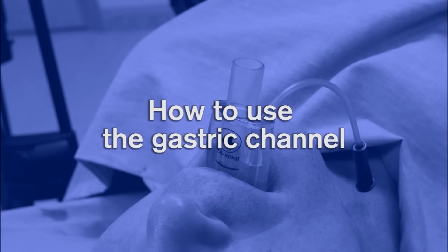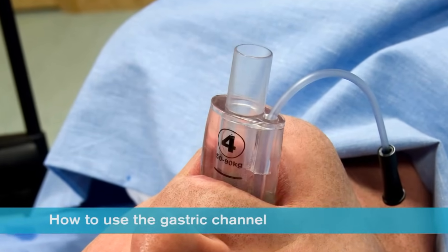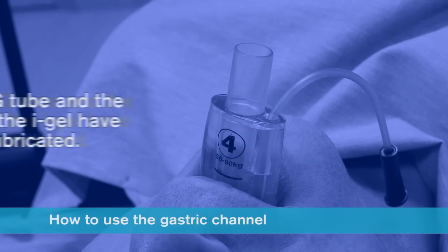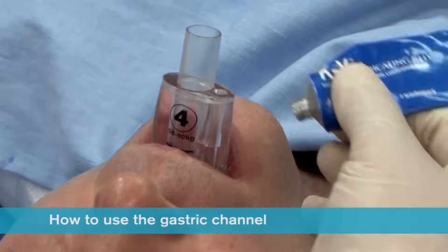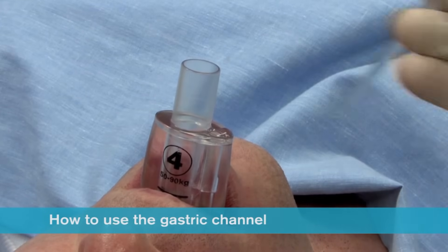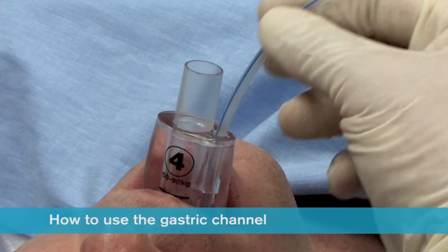How to use the gastric channel: If required, a nasogastric tube can be inserted down the gastric channel of the iGel. For a quick and efficient insertion, it is important that the nasogastric tube and the gastric channel have been adequately lubricated before insertion is attempted. The ideal way to achieve this is to place a small bolus of lubricant over the proximal end of the gastric channel. The nasogastric tube should then be inserted a short way down the channel and moved in and out to prime it before completing insertion.